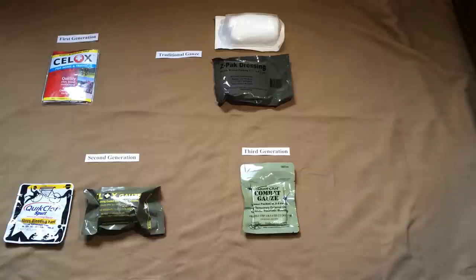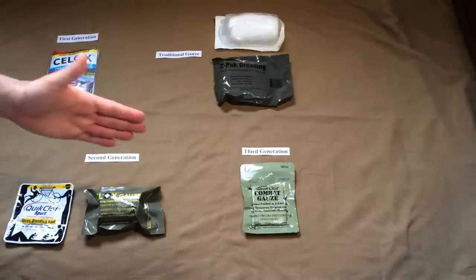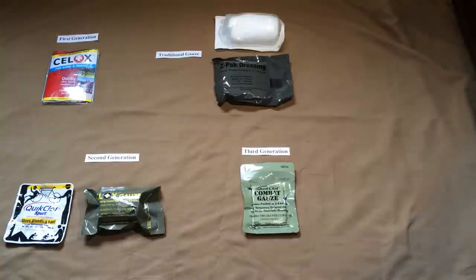I encourage you to look at the reference material listed below this video — none of this is just my own opinion; it's all well-researched and documented in studies proving the relative effectiveness of these products. What's interesting is that, other than the powder's unfortunate burn side effect, and the obvious benefits of second and third generation over first, when it comes to these generations versus standard dressings, a couple of studies have shown that standard dressing, if applied properly, is equally effective. That may sound strange — why is there even a market for these?